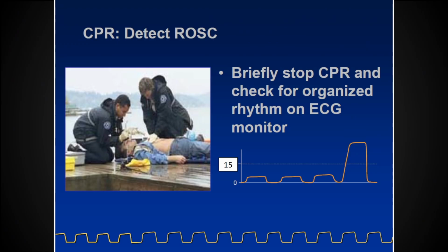Now, if we're rocking an end tidal on a patient and it's whatever, whether it's 10 or 20 or 40, and we suddenly see a jump of 10 to 30 points or something, I don't have a test question that gives a specific number. But if I'm just watching them tick along in cardiac arrest and suddenly see that, what do I want you to do? Check a pulse.